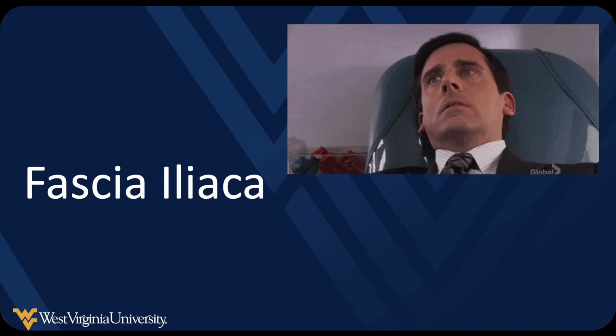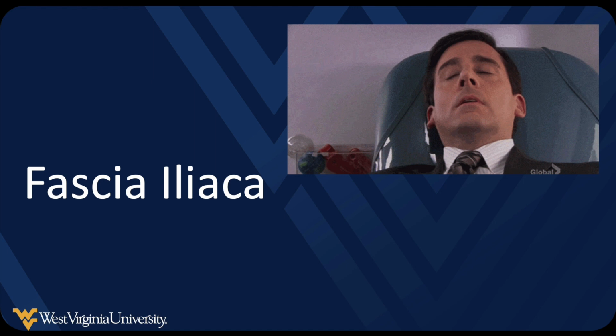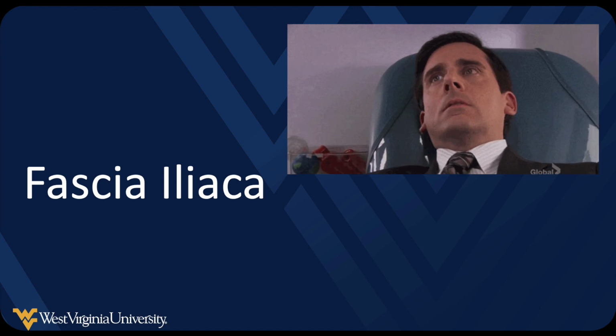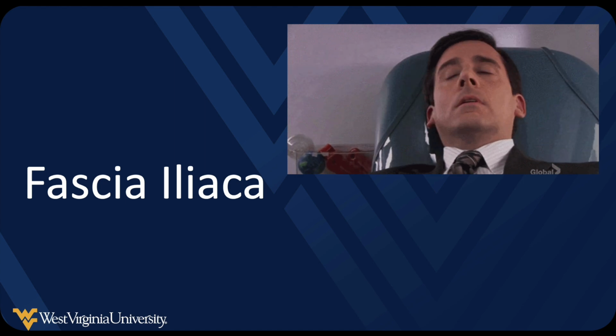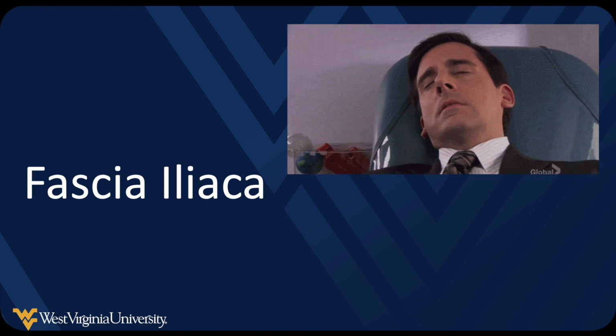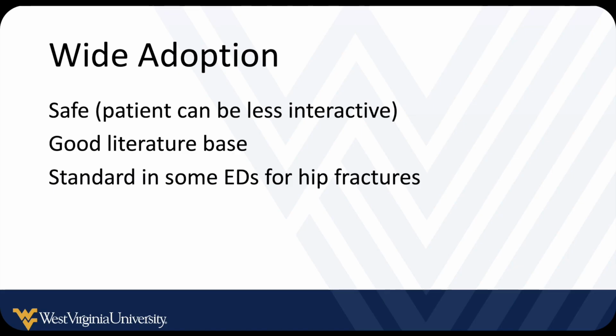And again, if you were asleep, if I knocked you out, wake up for this one, because this one is the highest yield, probably one of the first ones that you might start doing as a regular part of your practice, if you're not already doing this: the fascia iliaca compartment block. And why? It's been widely adopted. It's been shown to be very safe. One nice thing about this is your needle's not really that close to the actual nerve or the artery. So in theory, maybe your patient can be a little less interactive, although I still think they should be awake and able to interact with you.